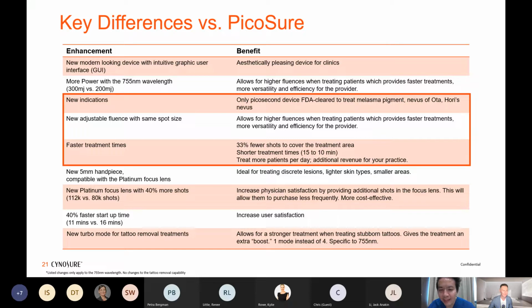It's easier, and there's a lesser chance of PIH. You can just whack it, because Caucasian skin has less melanin, so you can really harness the power of collagen production and elastin production. You can treat fine lines and wrinkles very well. So it's a no-brainer as well for a Caucasian-skin-dominated patient pool. Yeah, whack me with your Picosure, the strongest, Dr. Wong.